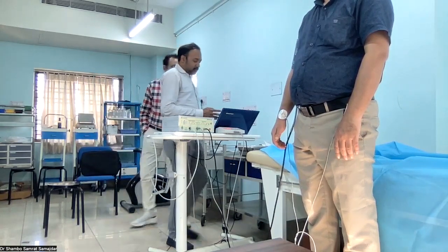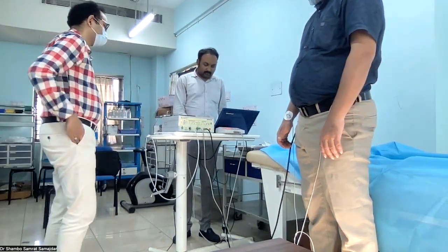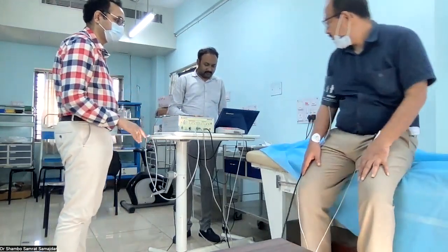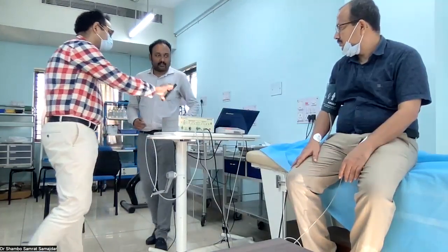So you have got all the readings, three readings, and we are going to save the data. Already, whether orthostatic hypotension is there or not, we had checked. Now the next part is the hand grip test. So this is the hand grip, please demonstrate.